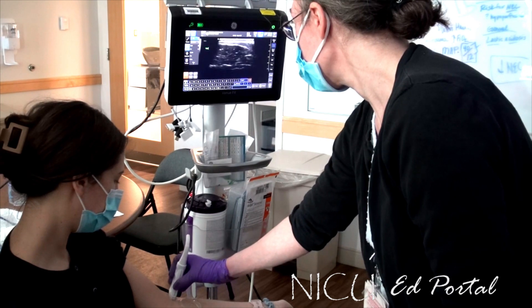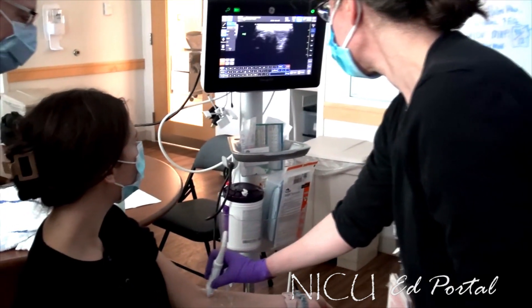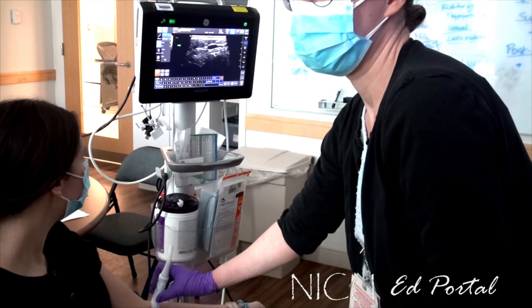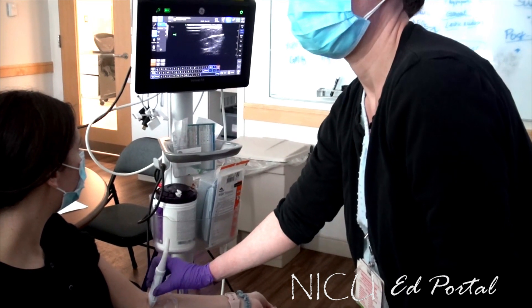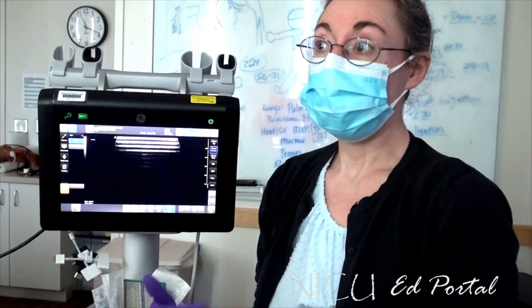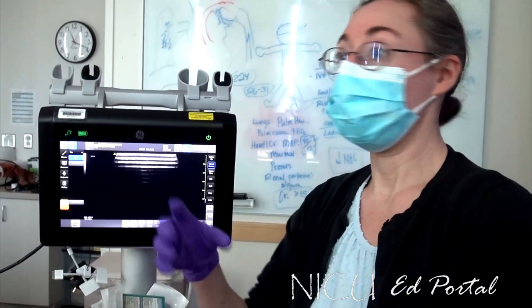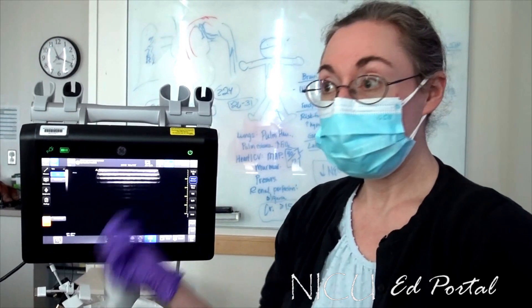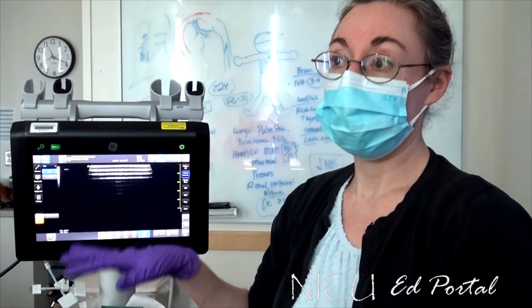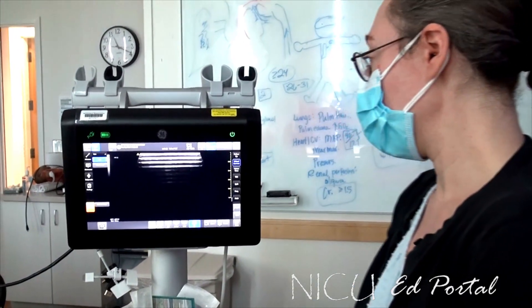If we're going to look for a vessel, we want to make sure first and foremost that we're putting this catheter in a vein not an artery, because you really don't want to give TPN into an artery. So if you want our help — if you're saying we're not sure what we're looking at, we're not sure where this line is, or we found something we don't know what it is — take the images and we can look at them, but it really helps if they're labeled and if they're acquired by convention with the probe facing the correct direction.